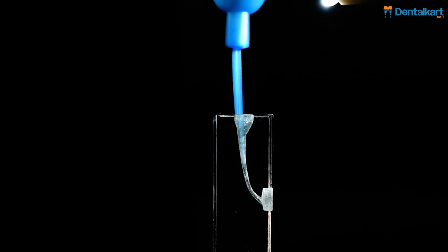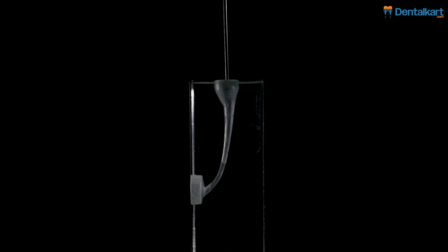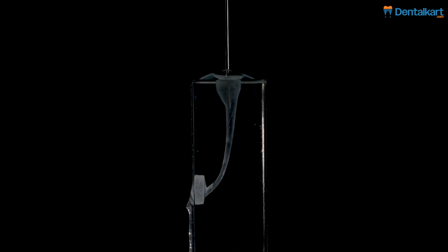Use a pumping action to move the activator in short 3 mm vertical strokes. Post irrigation, remove debris and assess cleanliness before proceeding with further treatment steps.